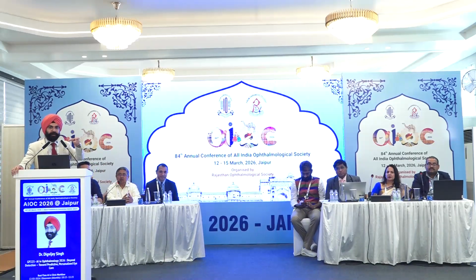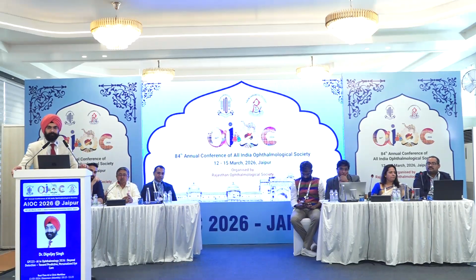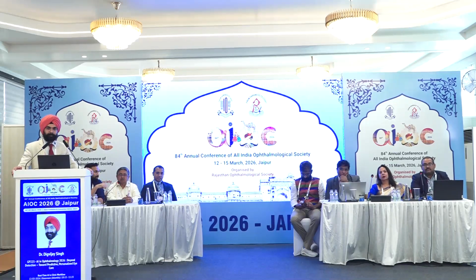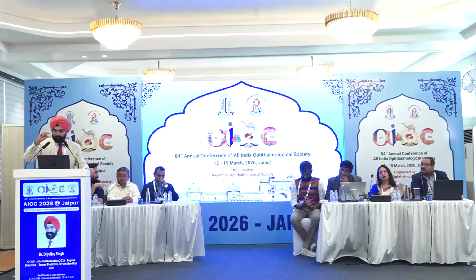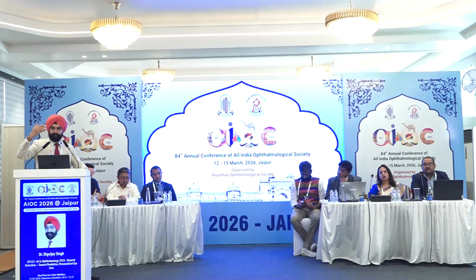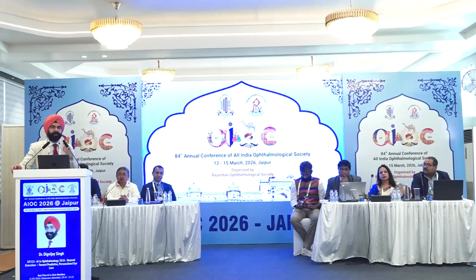Ultimately the idea is it should be integratable with any EMR, provided you train it for that EMR, because you have to tell it these are the fields. Each EMR may have a slightly different field of how that's entered. So it's more like an AI scribe, but the only difference is a scribe would write literally what you say. You would say YAG-PI done, and this would convert that into a summary: YAG-PI done on so and so day, initial IOP was this, final IOP was this, patient was put on acetazolamide.